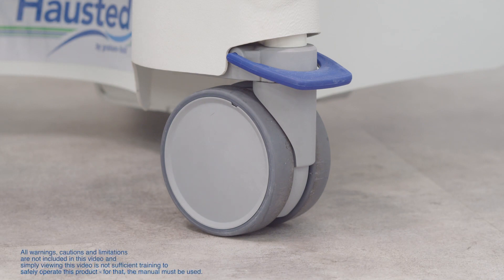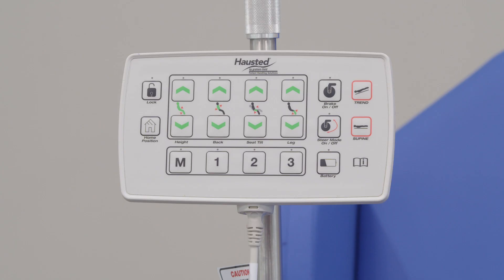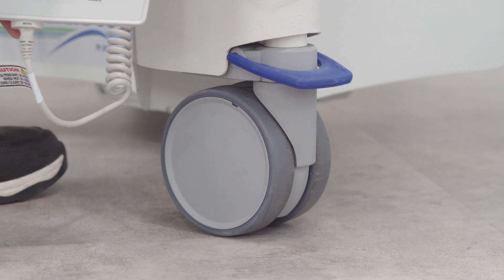Thank you for using the Hausted ESC2 Procedure Chair. We're going to be providing an overview on the intuitive electronic caster system featured on this chair.